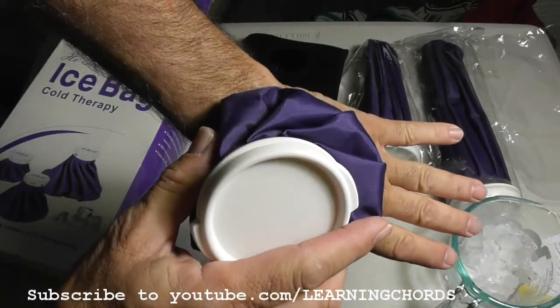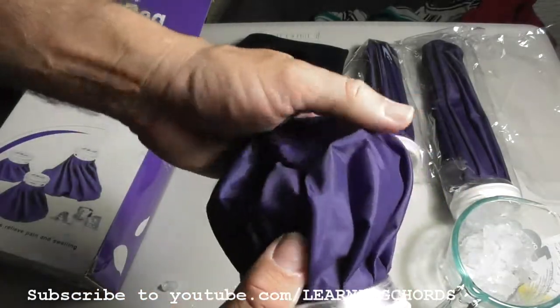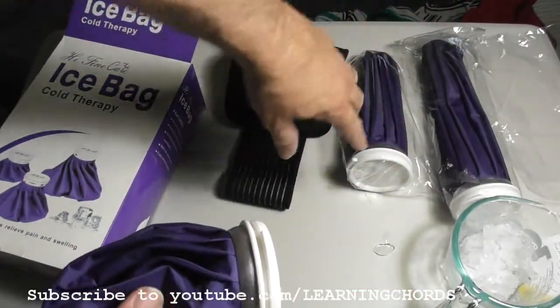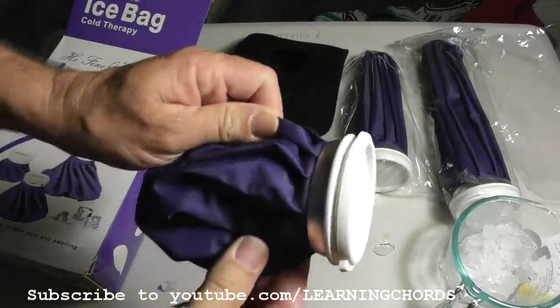It's cold. The nice thing about this is everybody has a freezer and everybody has ice cubes. So you can constantly refill this thing all throughout the day. If you have all three of them, you can just fill them up and have ice waiting for you all day long for your aches and pains.